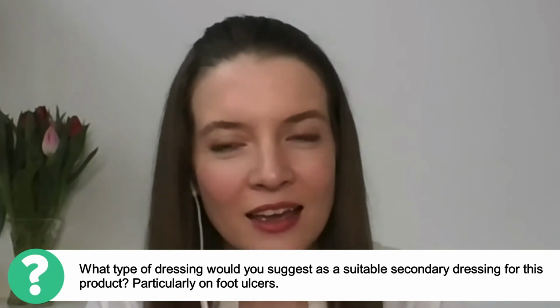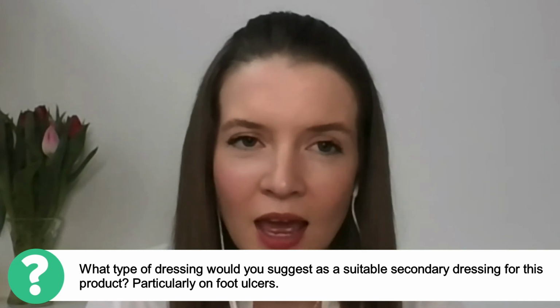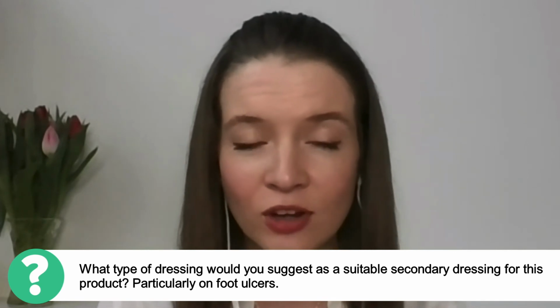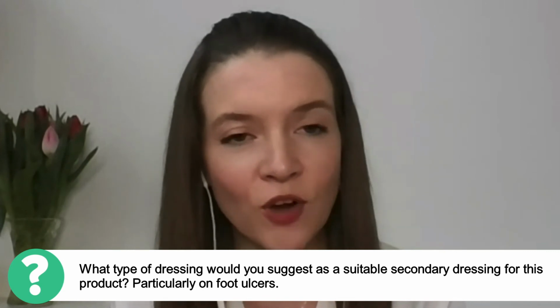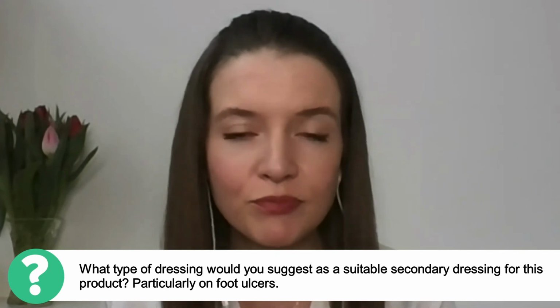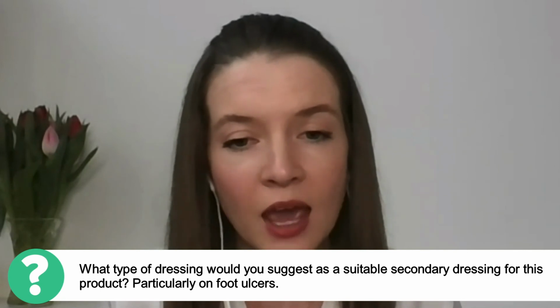Thanks, Jenny. That is actually a really good question. So we do recommend a bordered foam dressing. And as Sarah mentioned before, you want something that is going to have a certain degree of absorbency, so the exudate can transfer from the Exufiber dressing to that secondary dressing, and also reduce the risk of skin maceration. And I also recommend choosing a dressing of appropriate size as well. So that's really key.